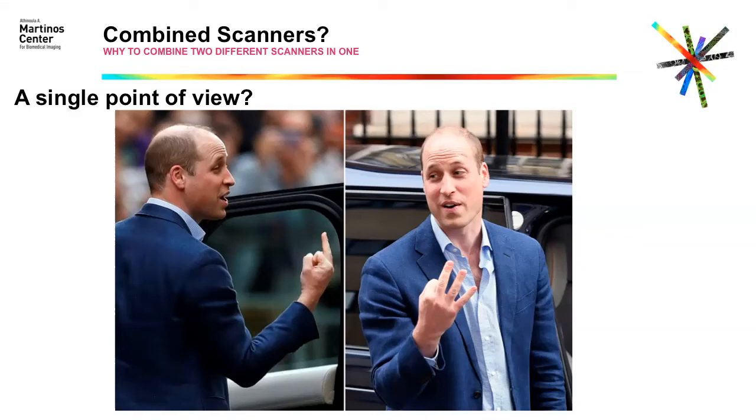Yes. So why combine two scanners? It's because then we can get not only one single point of view from the PET or the CT or the MRI, but from both combined together, and better visualize, better capture what is happening behind the disease that we are investigating. So the biological process behind that, we can capture from different angles. And that, in many cases, helps understand what is happening.